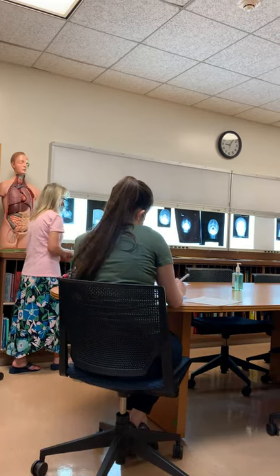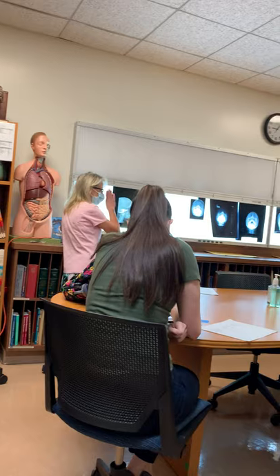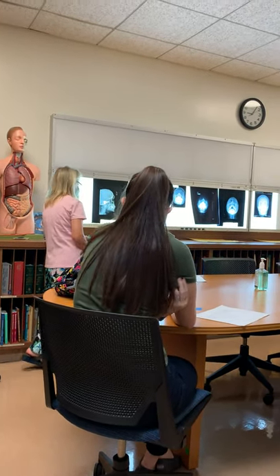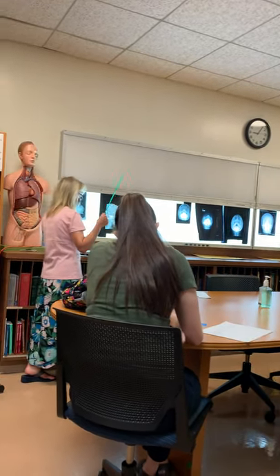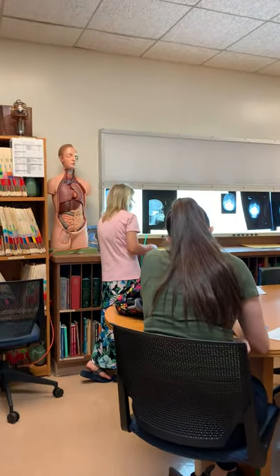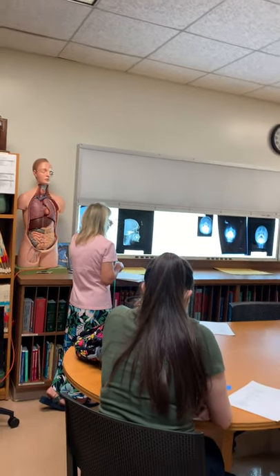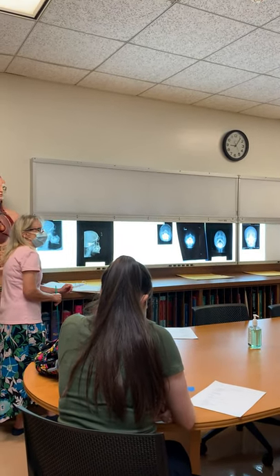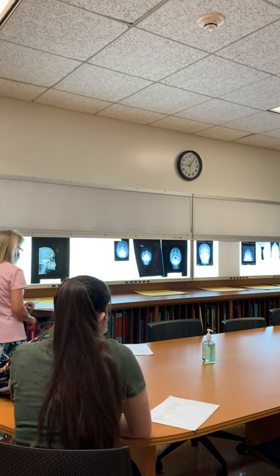Skull versus facials. For the lateral facial bone, you need to know the mid-sagittal plane is parallel with the IR. Same thing like we had today, the interpupillary line is perpendicular to the IR. You need to know the baseline again, it's the IOML. And this one, the center ray, is perpendicular to the malar, which is also known as what? Zygomatic. Good, which is also known as the zygoma.